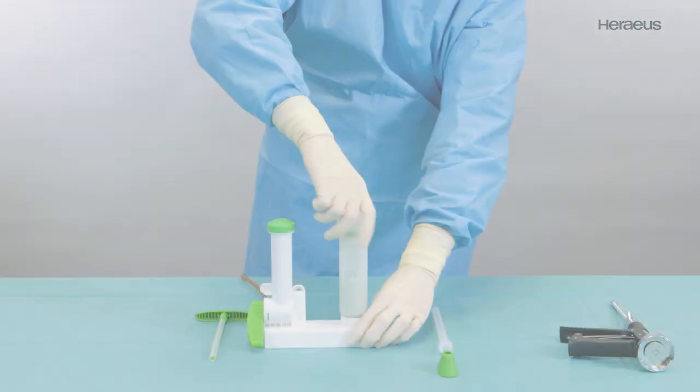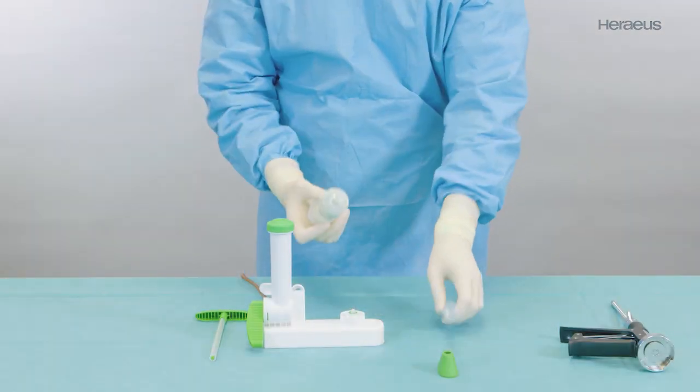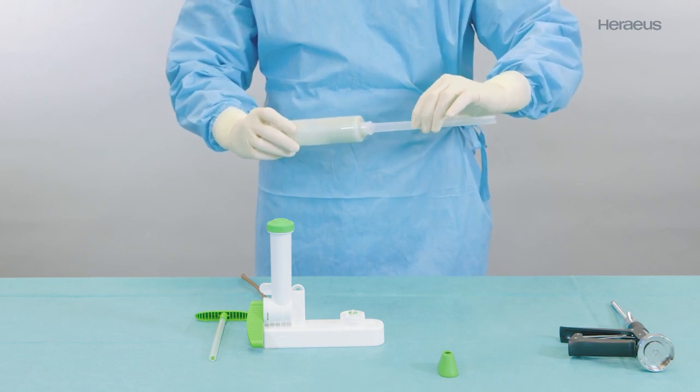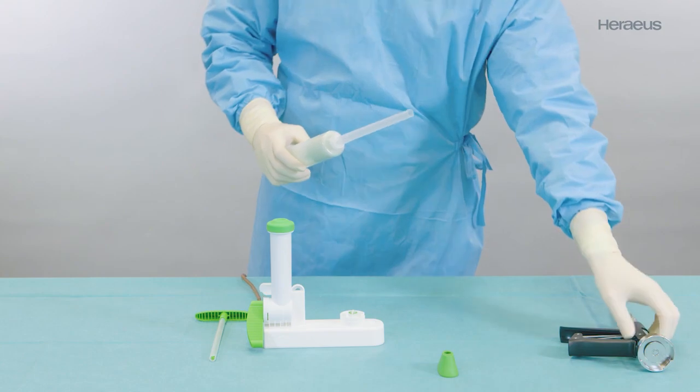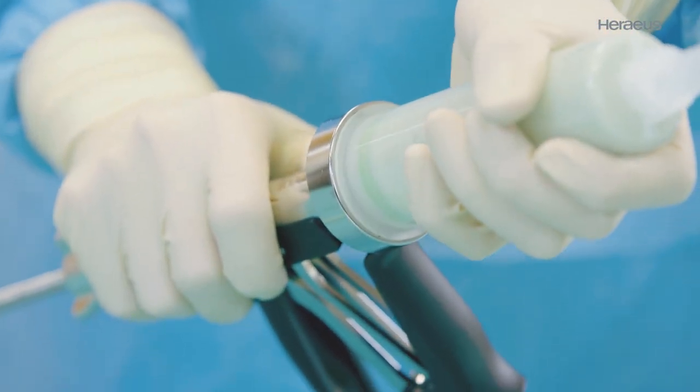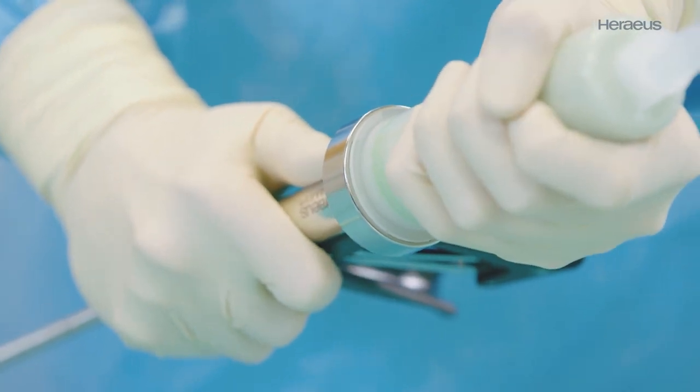To apply the ready mixed bone cement, screw the application nozzle onto the cartridge. Then screw the cartridge onto the cement gun with a short rotary motion. An audible click will ensure it is fully attached.